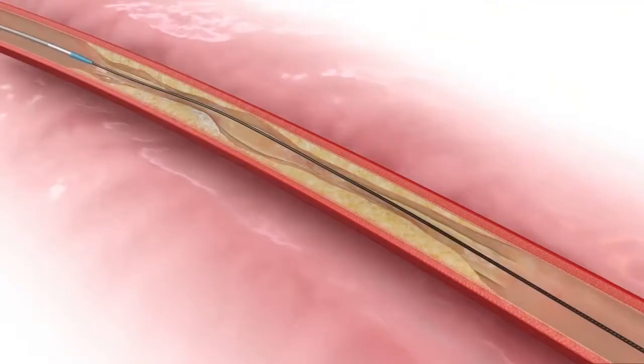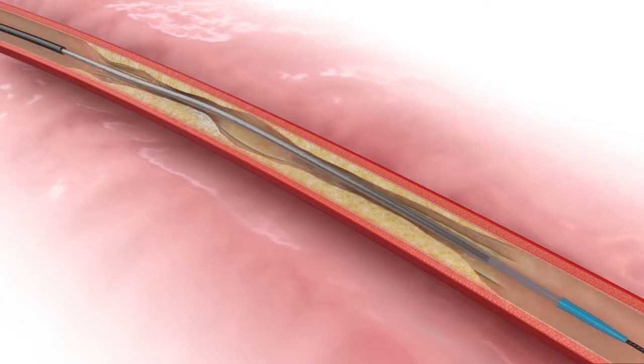Following completion of the Flex passes, the operator performs balloon angioplasty with the balloon of choice.